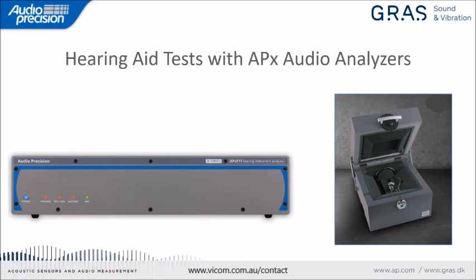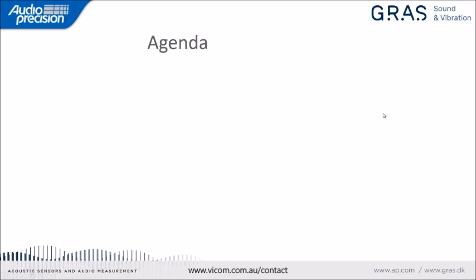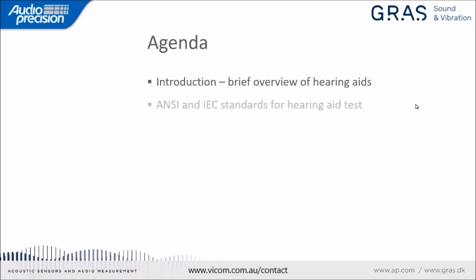All right, we have a lot of material to cover, so I'm just going to jump right into it. First, we'll look at the agenda for today. I'm going to give a very brief and simple introduction overview of hearing aids. I have a fair bit of expertise in audio tests and audio analyzers, especially Audio Precision analyzers, but I am by no means an expert in hearing aids, and if that's what you're expecting today, you may be disappointed. So just to set the expectation.